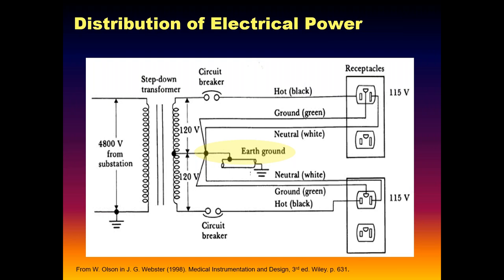And someone suggested checking the neutral ground voltage, just the voltage between neutral and ground, which theoretically should be zero, right? If you've got two pieces of wire bonded together, there shouldn't be any voltage across a piece of wire. Well, if you have some new construction, things get loosened up. If you start getting voltages, you know, 2 volts or more, that can really create some havoc with some of our systems. So I just had a little pigtail for my multimeter, just plug it into the wall, and I just measure that ground neutral AC voltage if there was any there, just to see. And every now and then you find something that was a little bit high, and you often didn't really know for sure, but that can create some havoc for you.